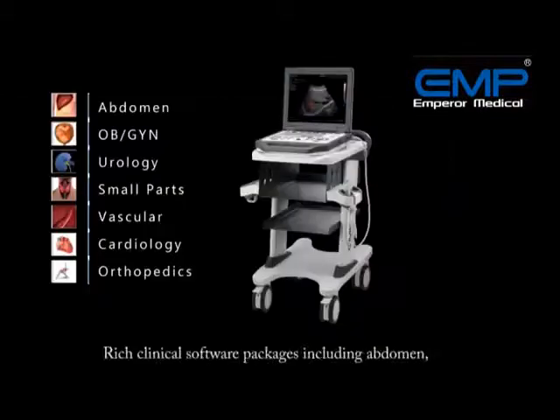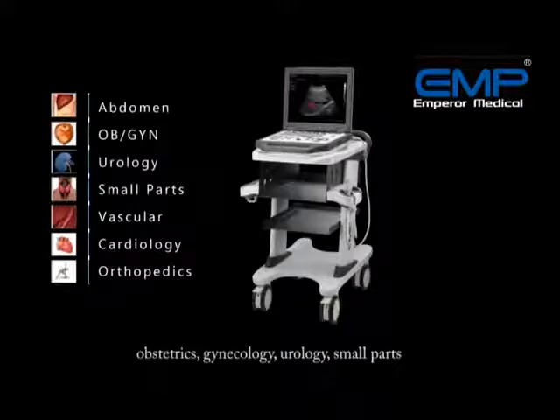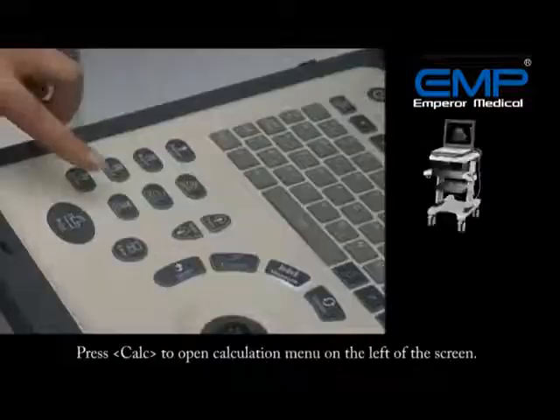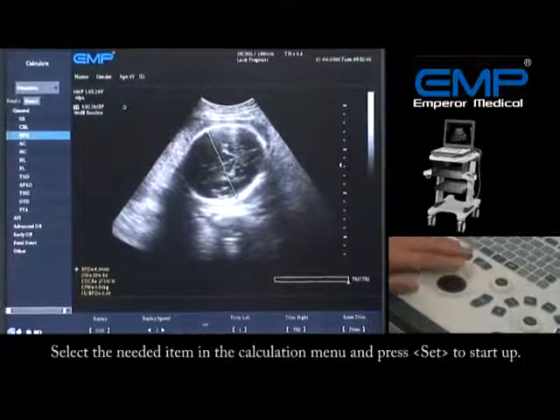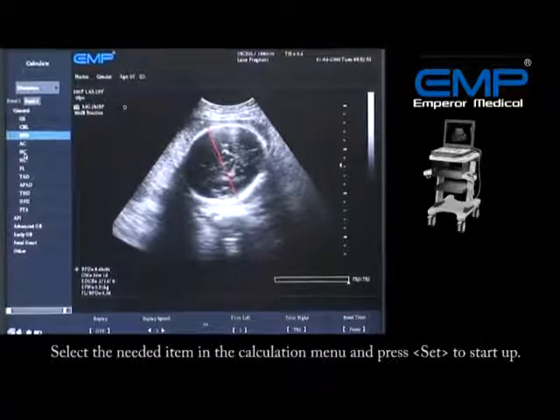Riceh clinical software packages — including abdomen, obstetrics, gynecology, urology, small parts, cardiology, and orthopedics — are applied on the G30 system. Press Calc to open the calculation menu on the left of the screen. Select the needed item in the calculation menu and press Set to start.